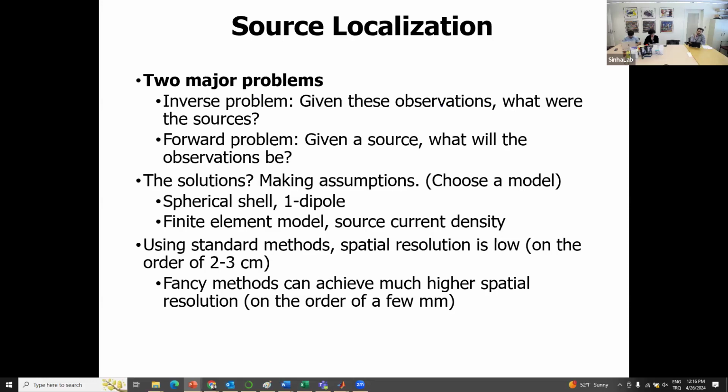But I'm going to jump because I've already started covering most of the basic pre-processing steps so far, and I'm left with a few others. So I'm going to go over all these extra pre-processing steps that are necessary to complete the standard pre-processing phase. I'm probably going to rush through them, so if you have any questions, or something that you want to explore more, just let me know so I can give more information.